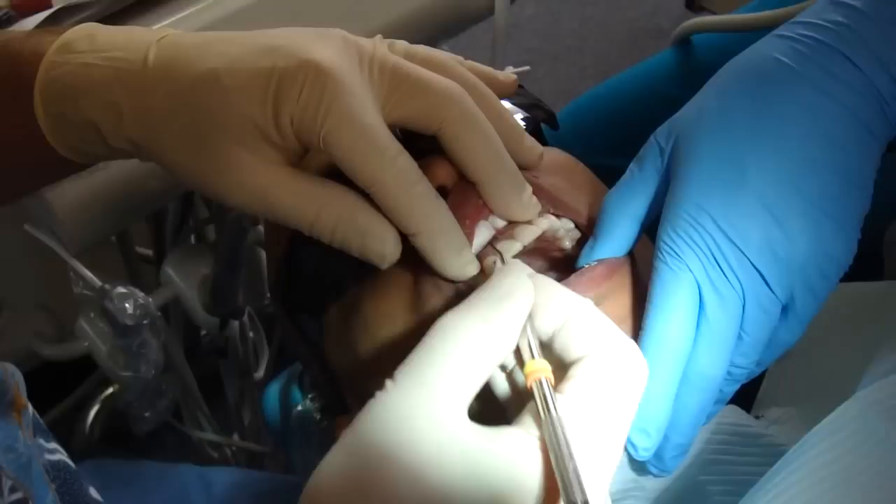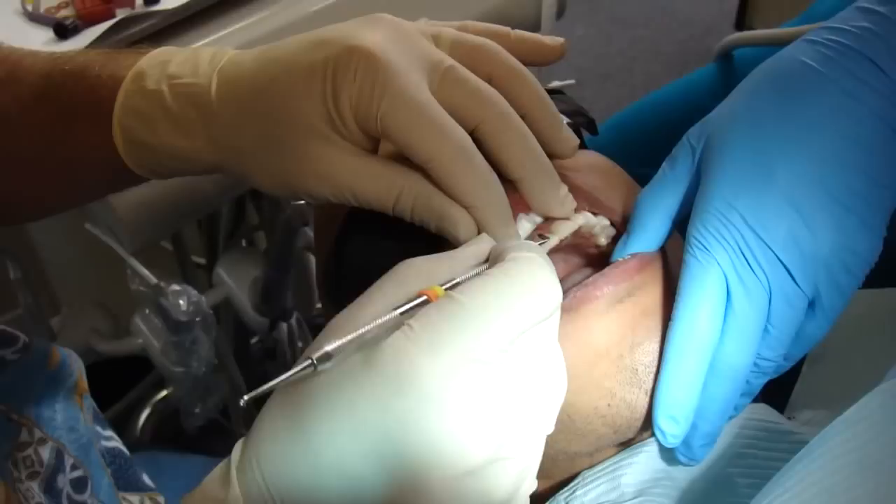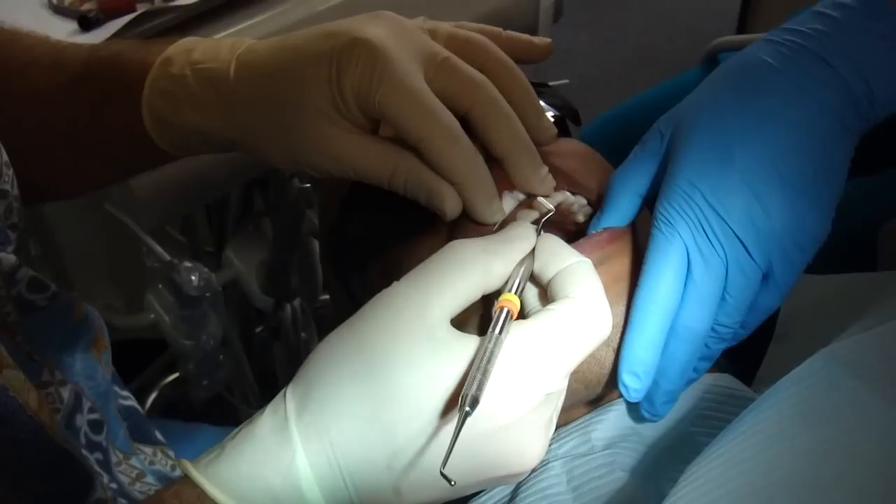So we're going to make these look as nice as we can so that Mo doesn't have to think about it, although he does have to be careful with the temporary veneers. That's pretty good. I'm going to polish those up. We're going to hit it with a light.